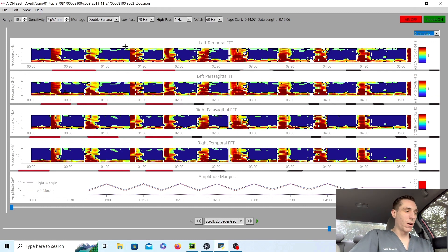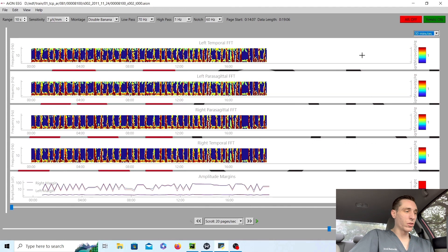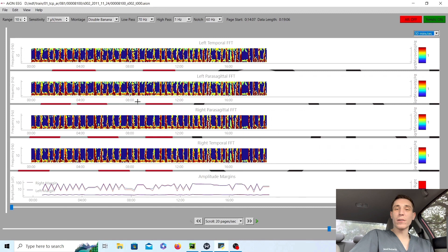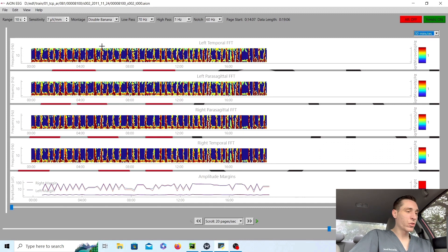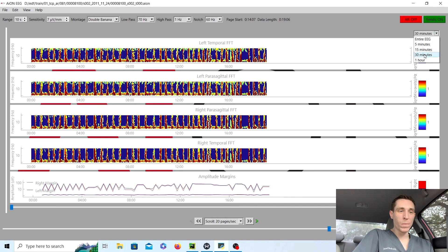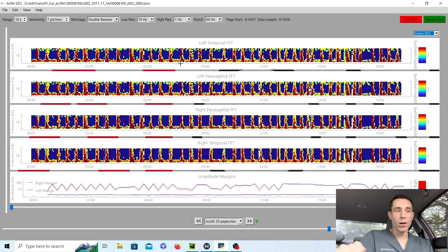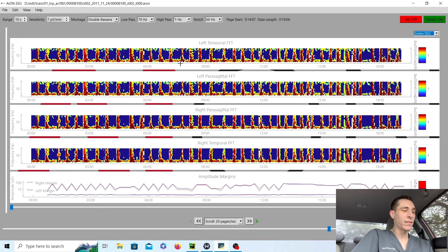Now, what do these look like? These look like stripes. So on quantitative EEG, on the trends, the typical pattern you'll see in a burst suppression are these stripes over and over again. Very important to know. And as a doctor, they can see how frequent are the bursts. How long do these periods of suppression last? You can get a lot of valuable information from looking at the trends.